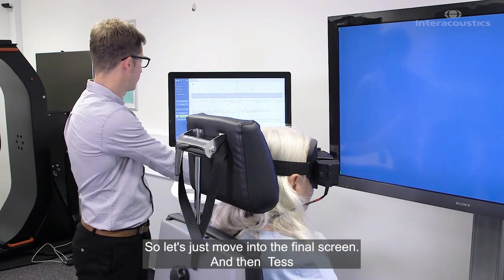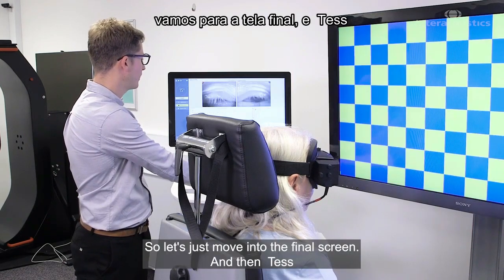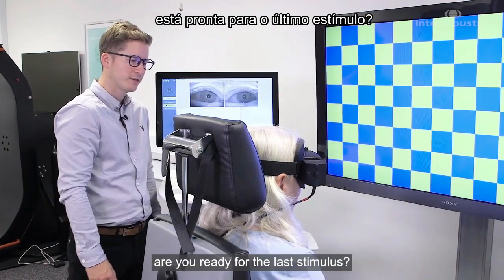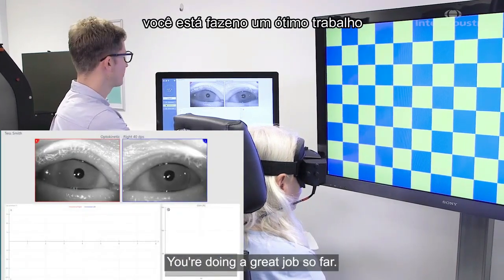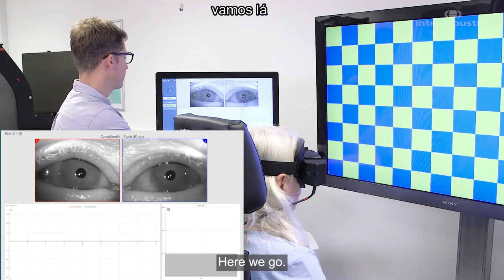Let's move into the final screen. Tess, you're doing a great job so far. Here we go, counting down from 15.